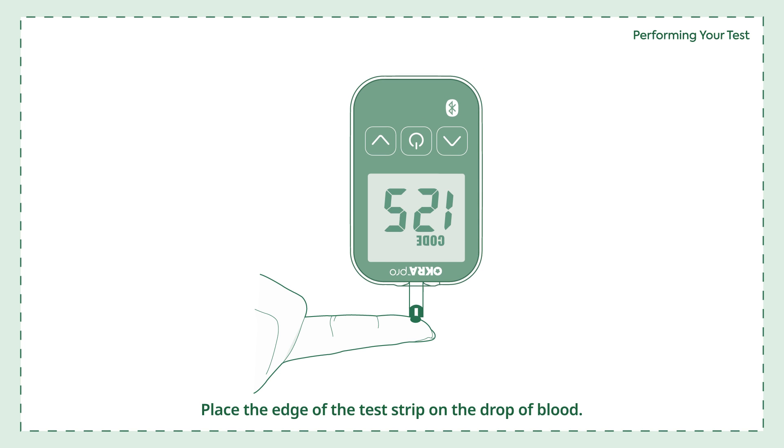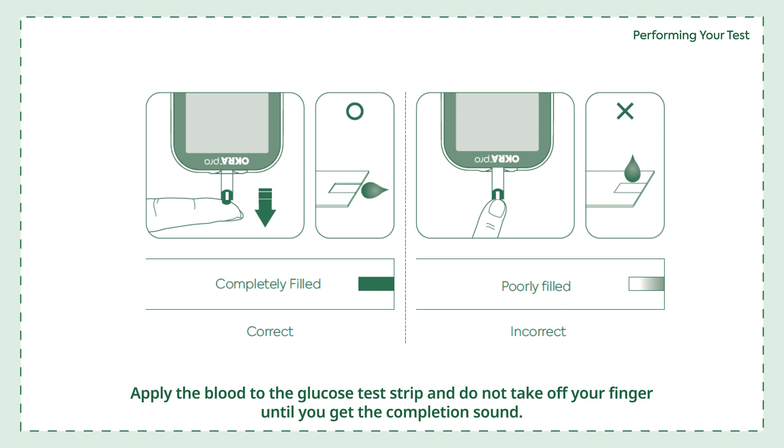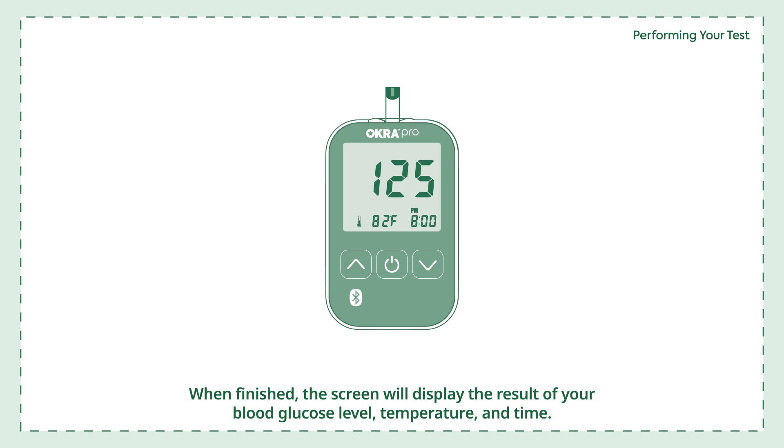To prick your finger, push the center button. Place the edge of the test strip on the drop of blood — the blood will be automatically drawn into the test strip channel. When your blood sample size is sufficient, your meter will automatically count down. Apply the blood to the glucose test strip and do not remove your finger until you hear the completion sound. After the beeping sound, the test will start automatically and your result will appear in 5 seconds. The screen will display your blood glucose level, temperature, and time.